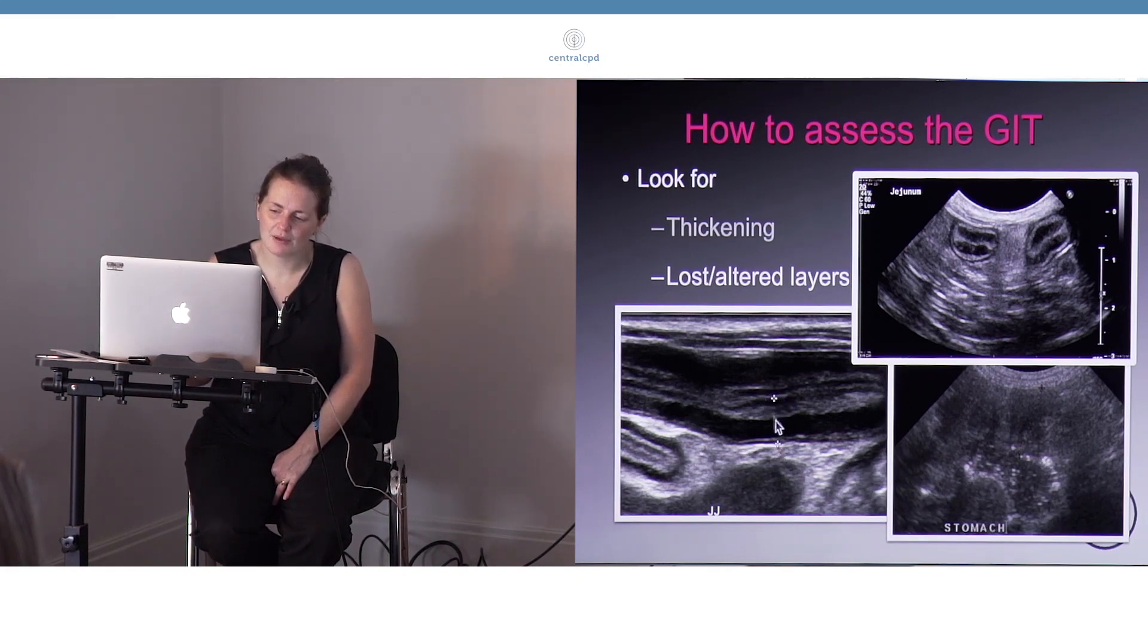This is the throws on the outside, but if you count, there's actually an increased number of layers. There's actually seven layers present, which is abnormal, and the way they are distributed is also abnormal. This is jejunum, and normally we'd expect the thickest black line to be this mucosal layer, and actually it's out here in the muscularis layer.